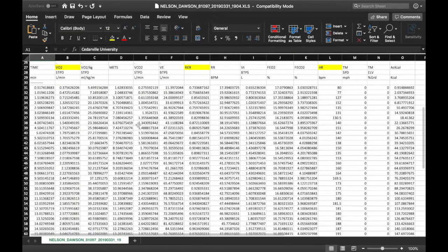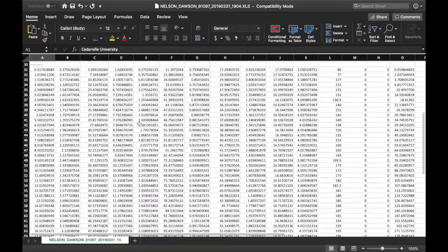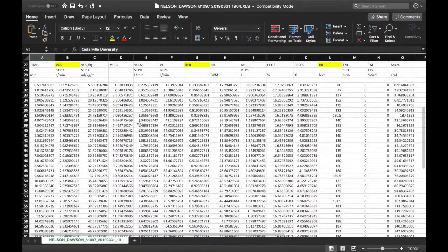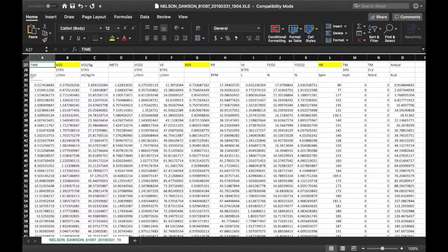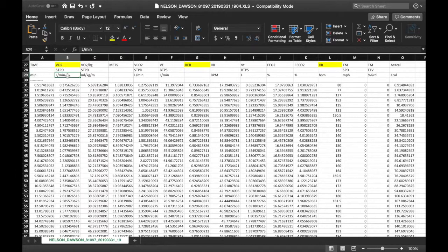Once we get down into the main table, it can look like a lot of numbers, but I promise it's really not too bad when you break it down column by column. Starting all the way on the left, we've got time in minutes. Next, we have volume of oxygen consumption in liters per minute.